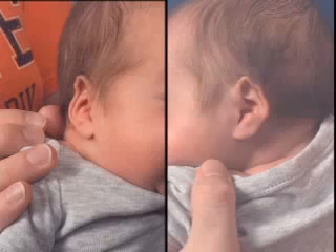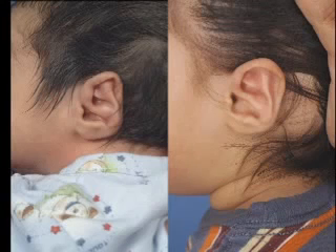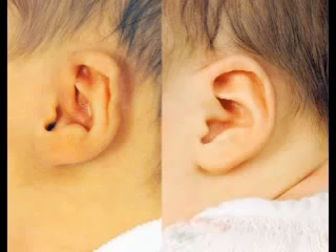There is no absence of skin or cartilage, in contrast to the constricted ear, so helical compression is a true deformation that can be easily reshaped with molding. It may also manifest as simple irregularities along the helical rim itself.